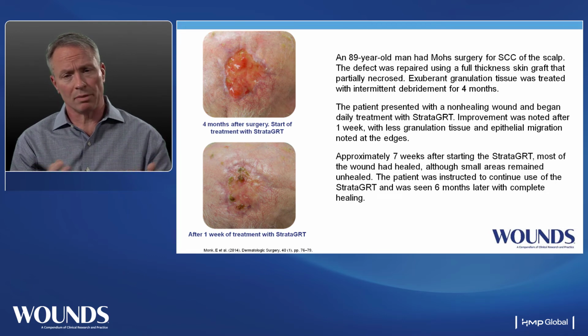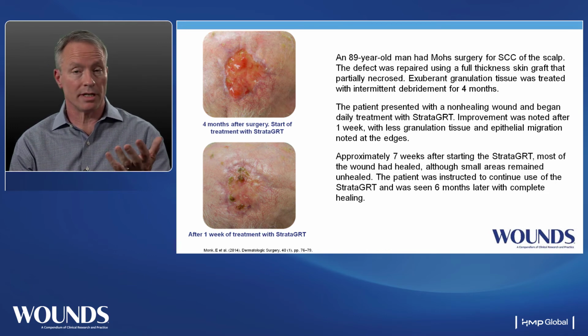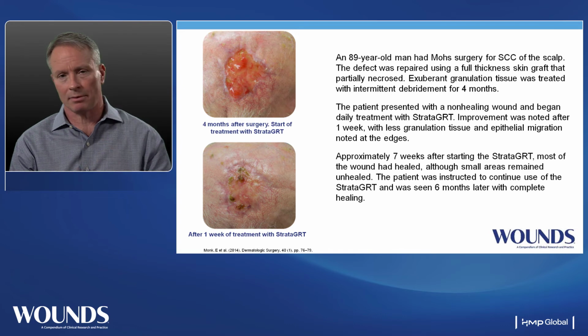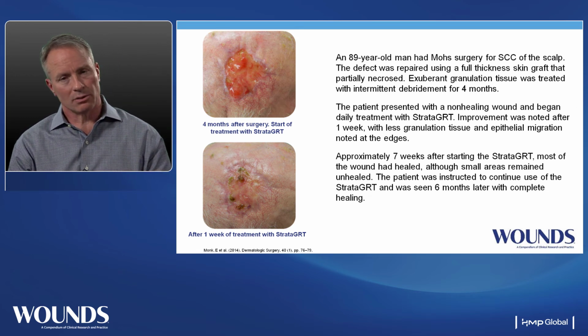When we look at older people as well that have a lot of dry skin, a lot of fissuring, this is another great aspect to use on the posterior heel, over the malleoli, anterior tibial crest, and those big old hammer toes that people can get that rub in shoes and create a chronic wound that can lead to devastating complications, as we see in our diabetics. Another excellent avenue to use on this dry, cracked skin.